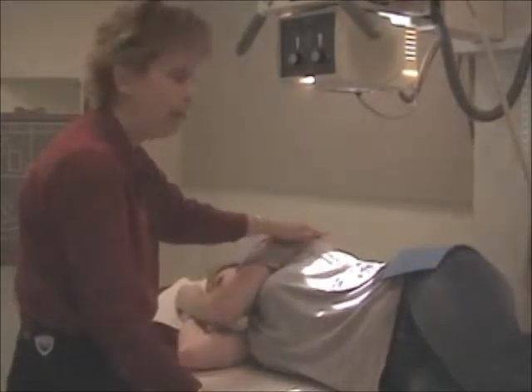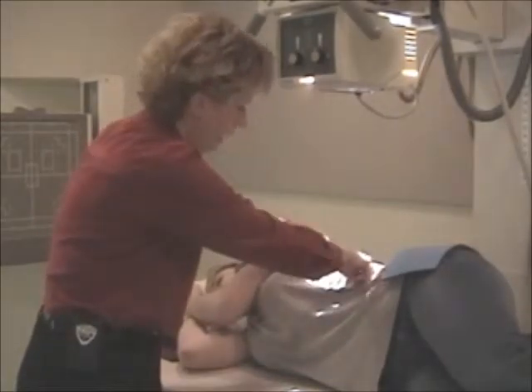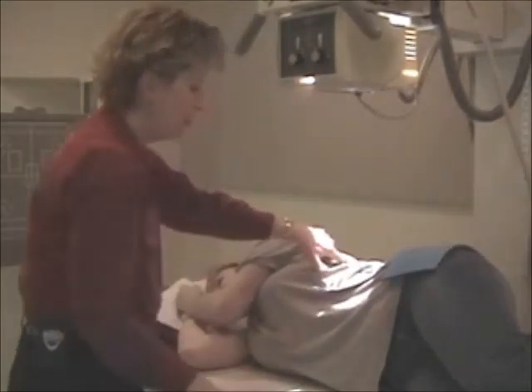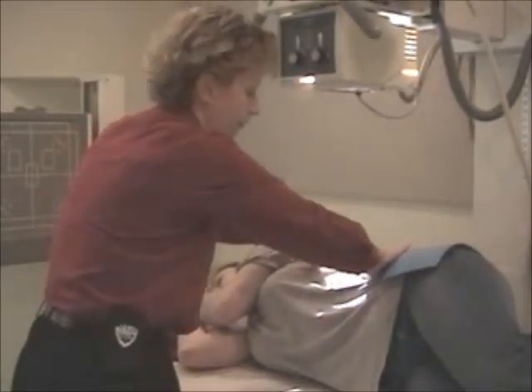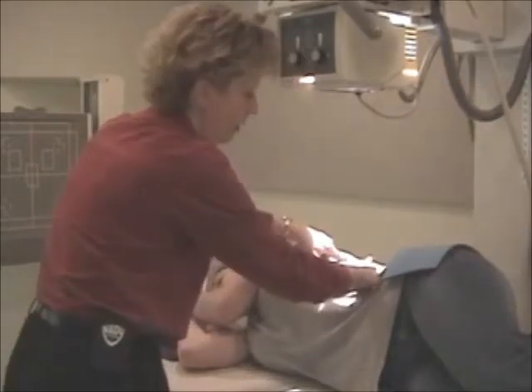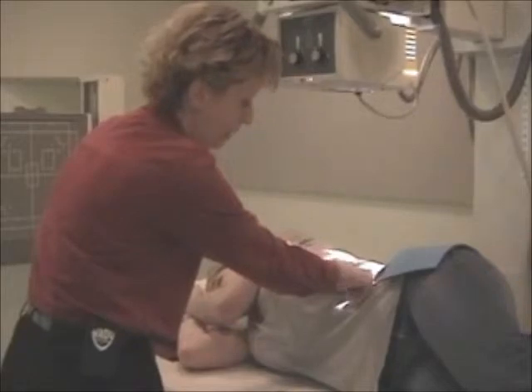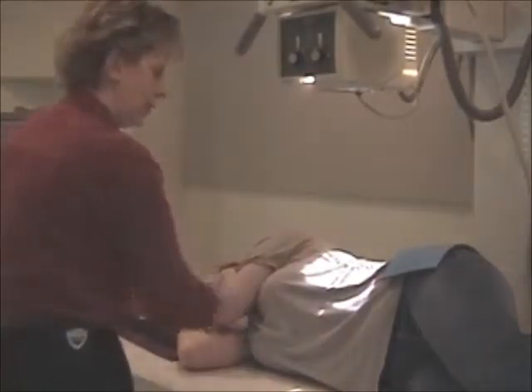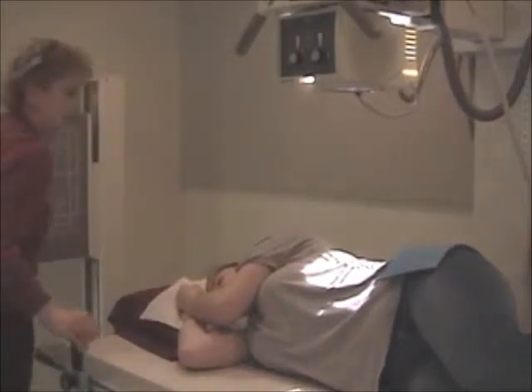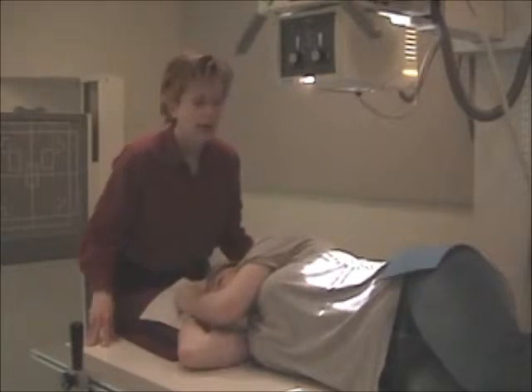So let me recap. Tip of the scapula, iliac crest, halfway, and 1 inch below. That will put you at the level of lumbar spine, L1 or L2. You can confirm by the iliac crest. 2 inches above is L3, so you can see that I am approximately at L1 or L2. That's for the vertical placement. And I consider Kristen to be a sthenic body habitus, an average level body habitus.